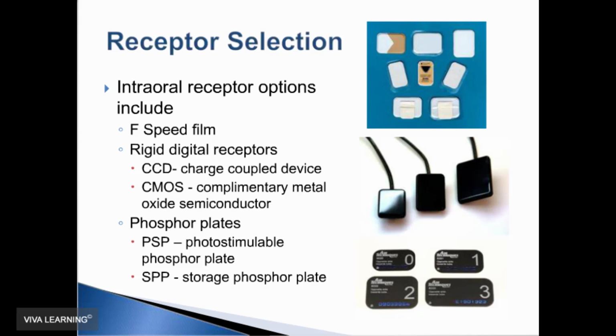With receptors, we have a number of receptors at our disposal. We have film. We also have digital receptors that are becoming more and more common in general practice.